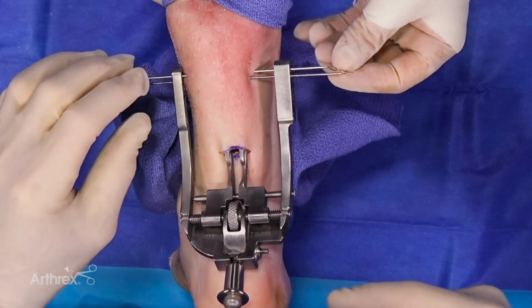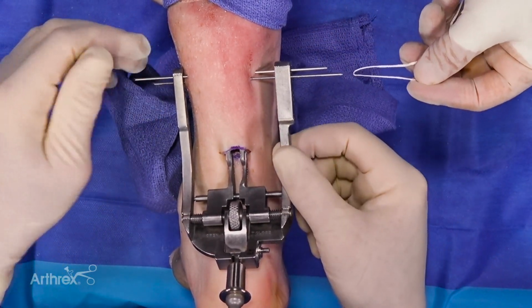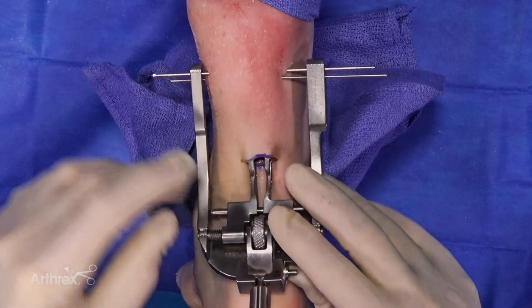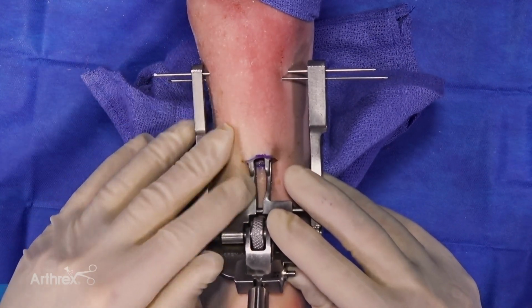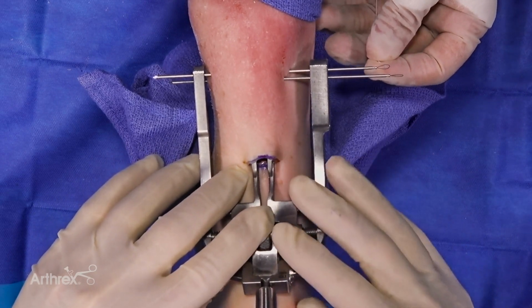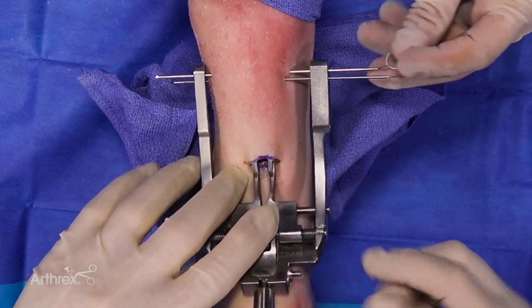And these first 2 are going to be your transverse needles. So now you can see I've got my first 2 needles in place and they stabilize the device. Now you can certainly put a third needle here, but instead what I'm going to do is stair step my needles down.